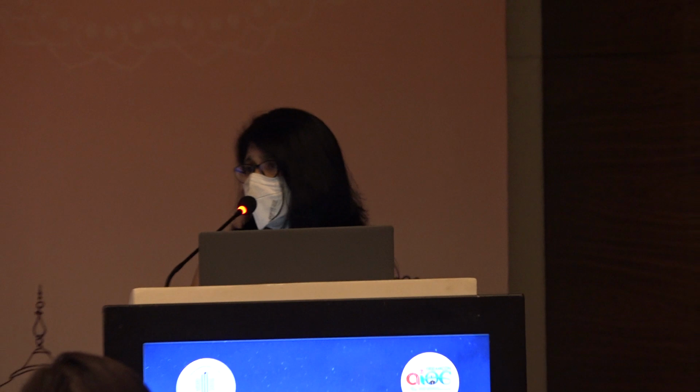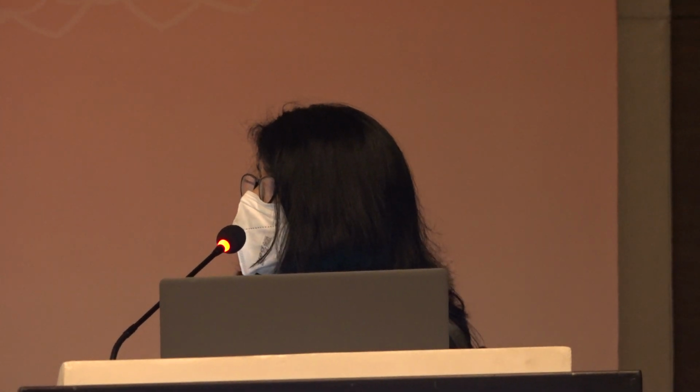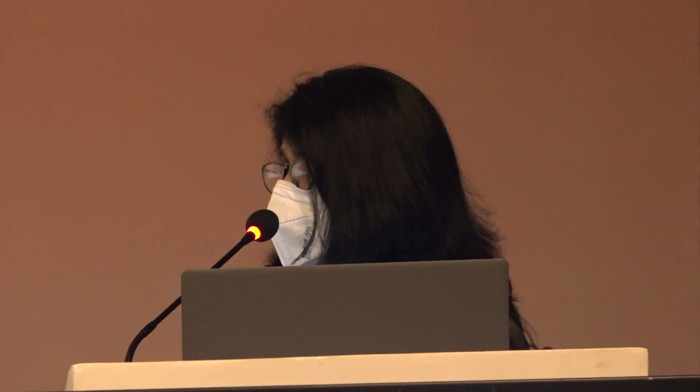That's what I said, that if the amplitude is 50% of what is there in the other eye, it suggests a good prognosis, vis-a-vis the flat wave. Also because of the medico-legal aspect which will always be associated with trauma. Yes, that's true.